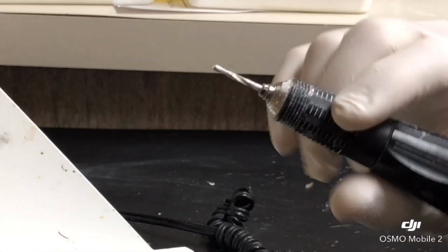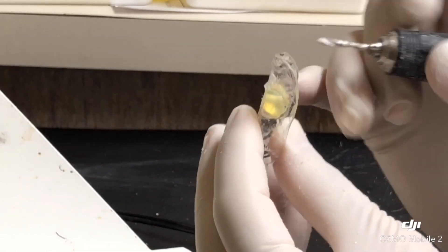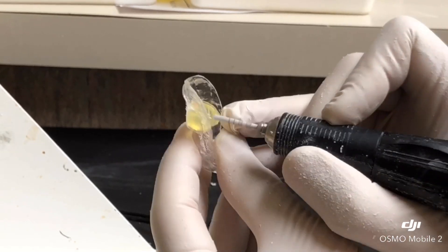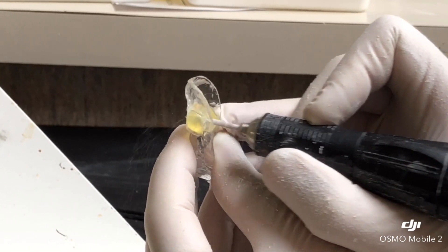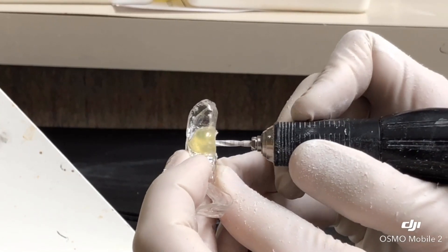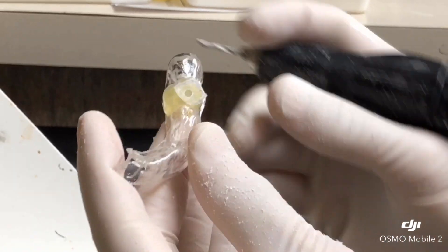Now we're using this zirconia burr and we have to make sure we don't alter the path. That's it. Let's make sure it has a tight fit. So this is all ready for the surgery.